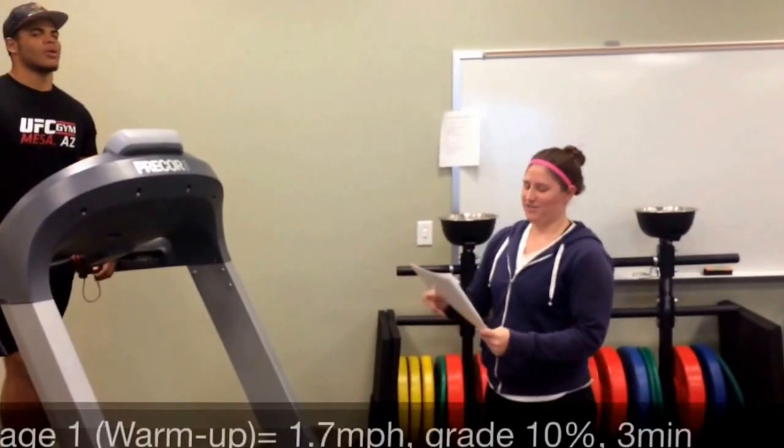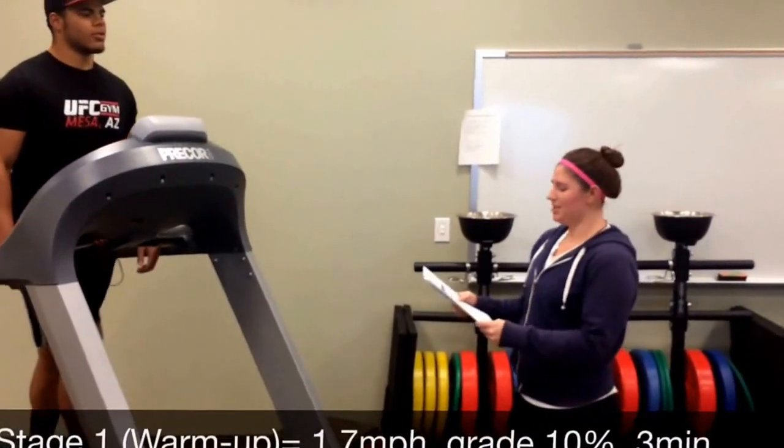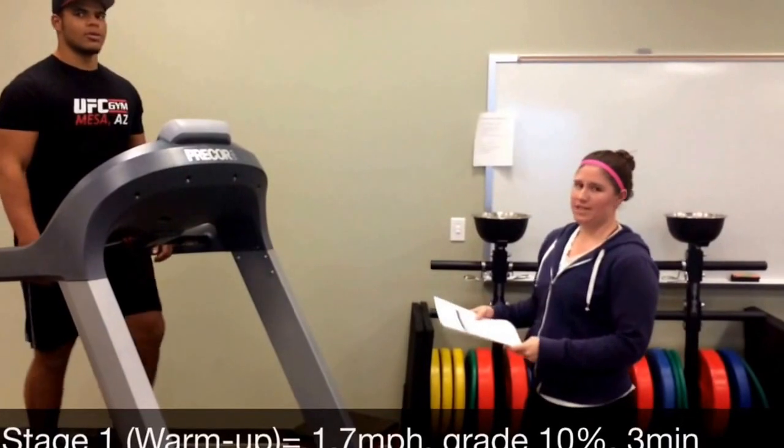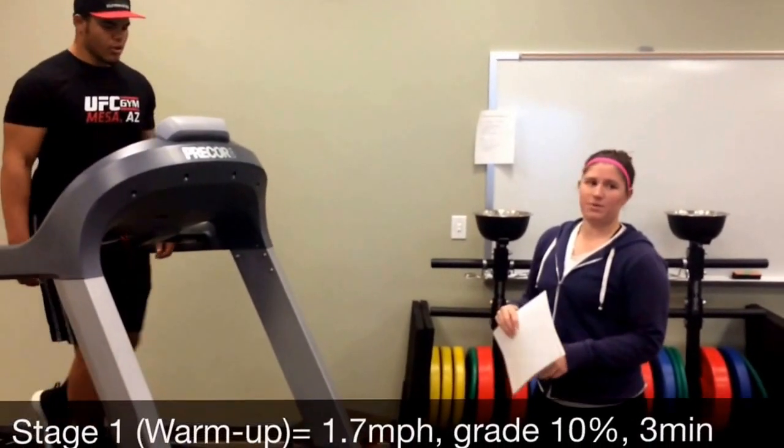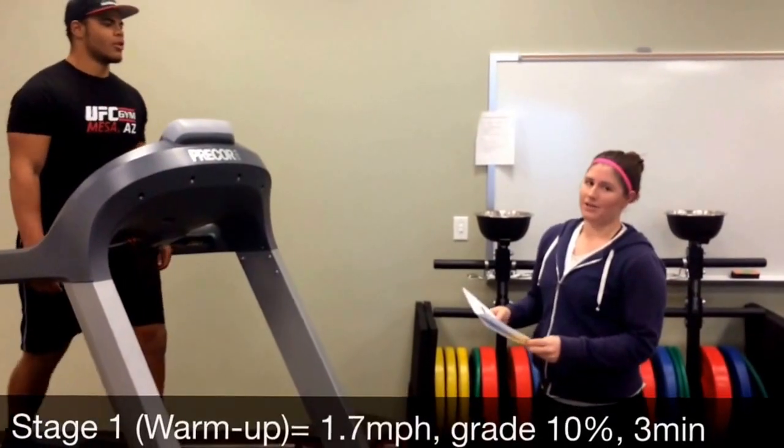This is a three-stage test of three minutes each. The first stage is also considered the warm-up. Right now he's at a speed of 1.7 miles per hour and a grade of 10 percent.